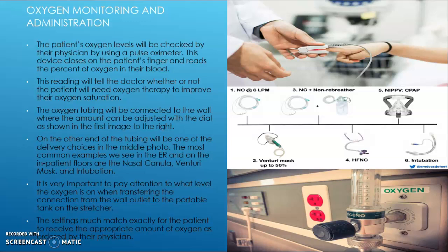On the other end of the tubing will be one of the delivery choices in the middle photo. Most common examples we see in the ER and on the inpatient floors are the nasal cannula, option 1, the Venturi mask, number 2, and intubation on number 6.